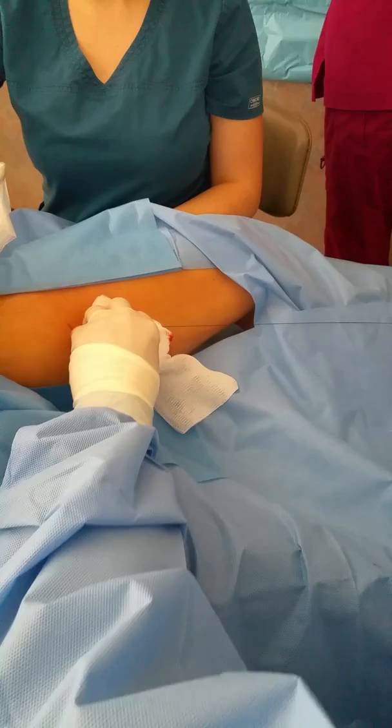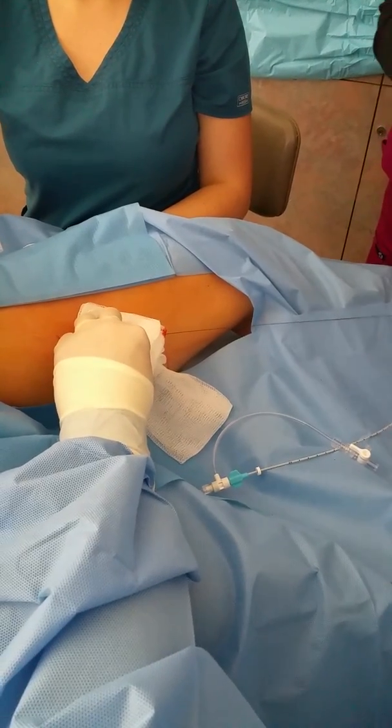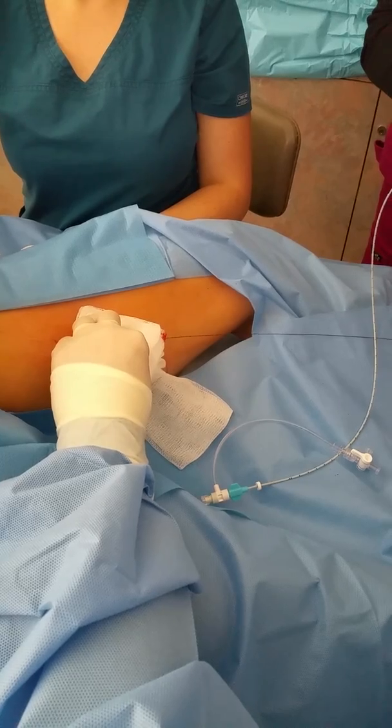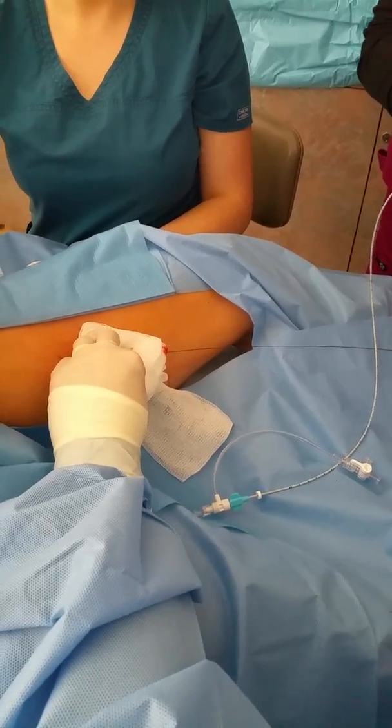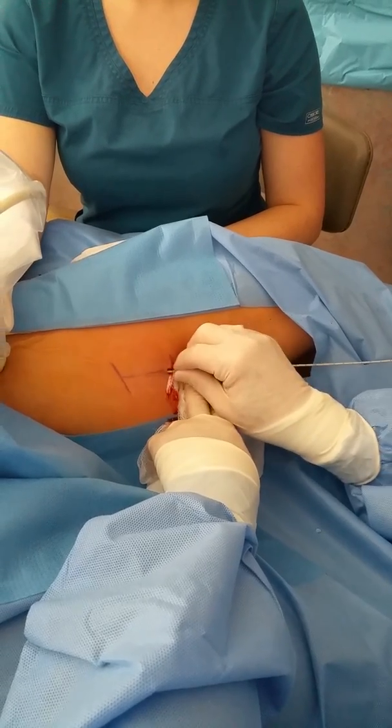How are we doing? Good. Nothing's hurting, is it? No. So now we've got the sheath on, we're just going to enter the vein.